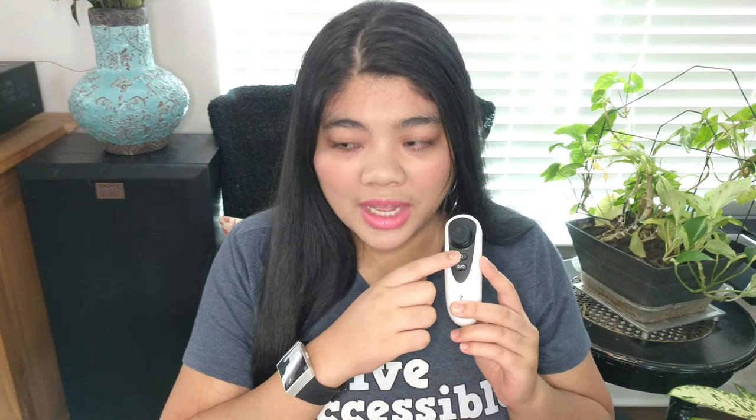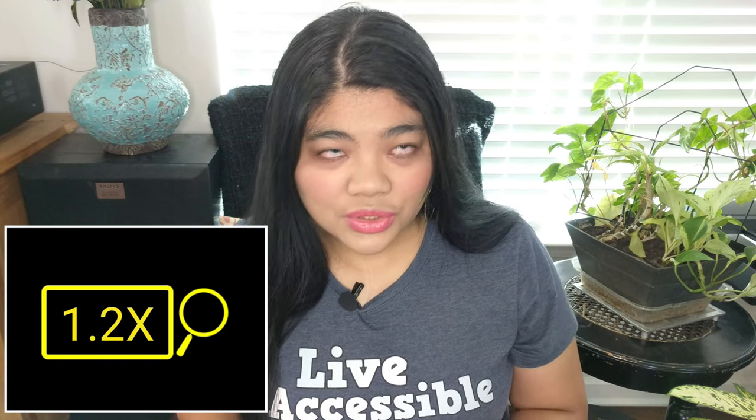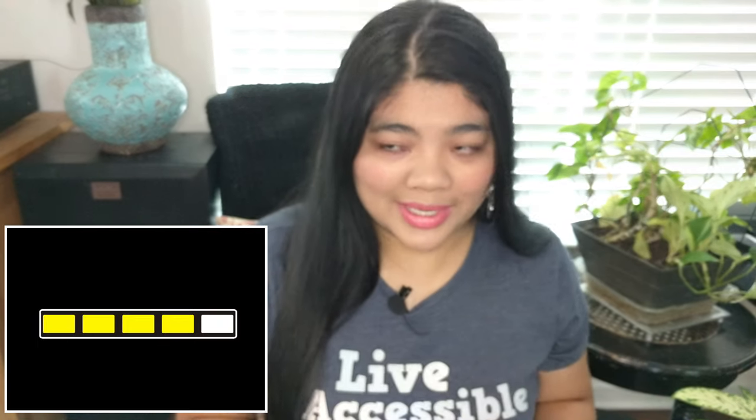Now there are some settings you can change on the Acesight VR, and to get to those settings, you want to press and hold that top button on the remote that's right under the joystick. So you press and hold that and you can get to the settings. And from there, you can set your default zoom. Then you can change the brightness of the screen. And then you can enable and disable color filters.